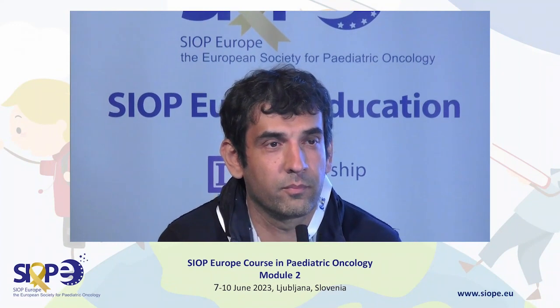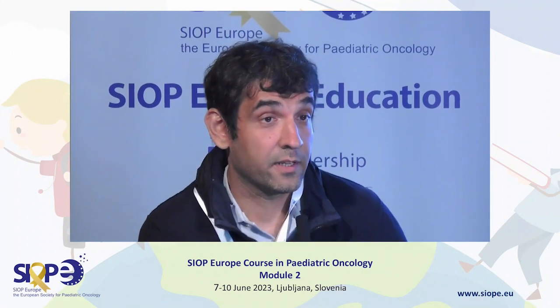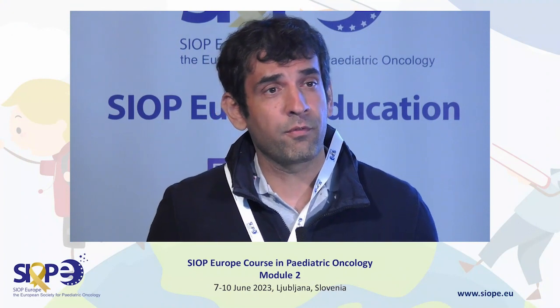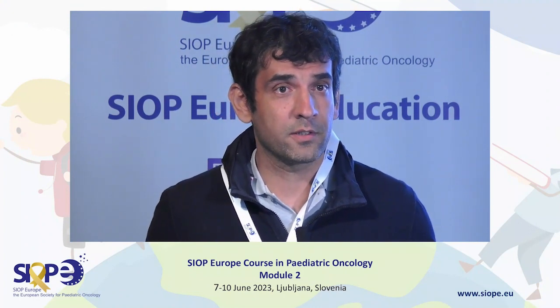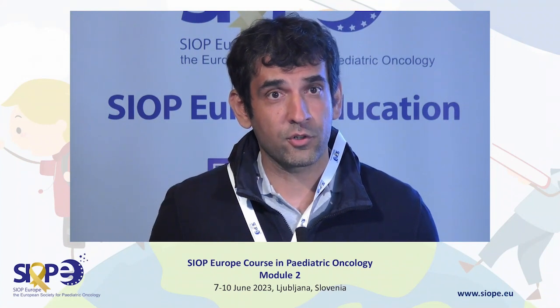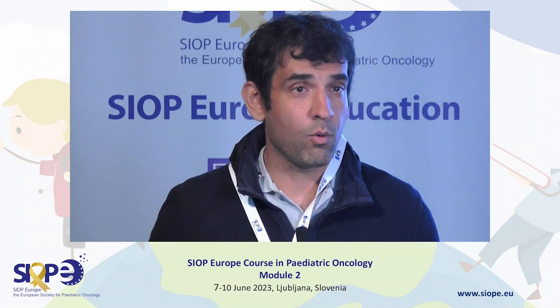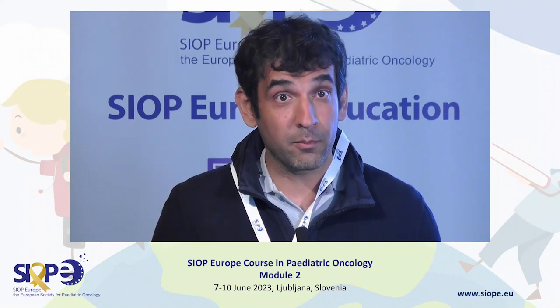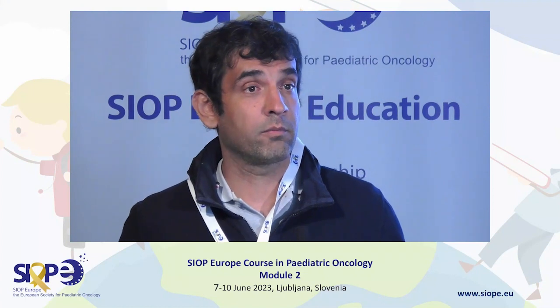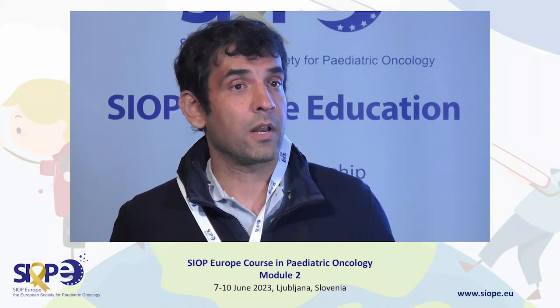For us, this is more of a question of, of course, differing from center to center. I can speak for our center and also some other centers. We perform everything in general anesthesia, but we don't do the lumbar or bone marrow puncture in an operation room. We do it on the ward. We always have an anesthesiologist available on the weekends and also during the night shift, so this is not a problem for us. And the microscope is in our general lab.